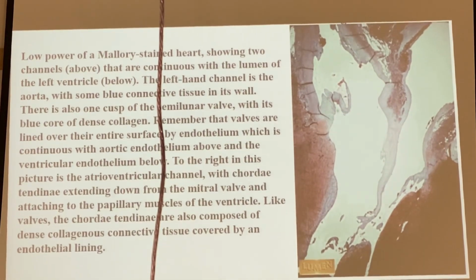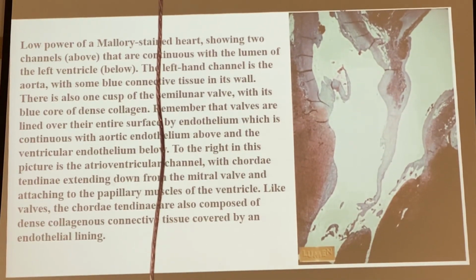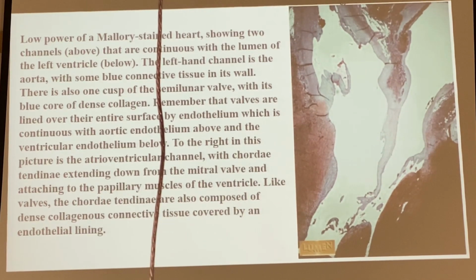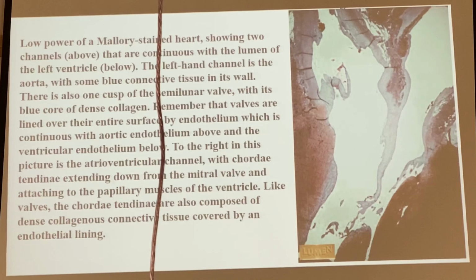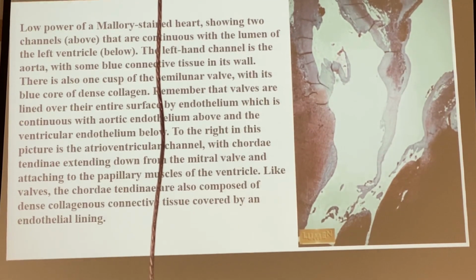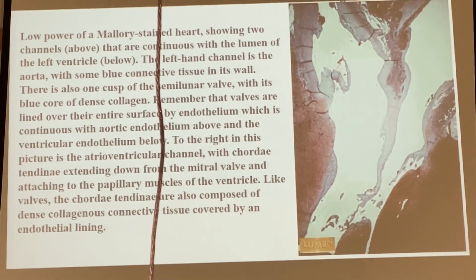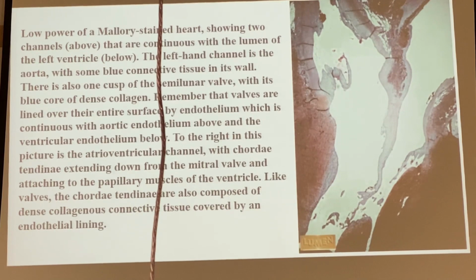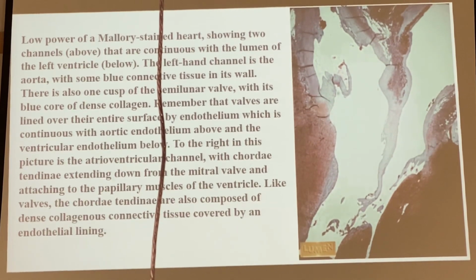So the core of the valve is connective tissue, covered on both sides with the endothelial layer of the endocardium, and the base of the valve has a small extension of the cardiac muscle.